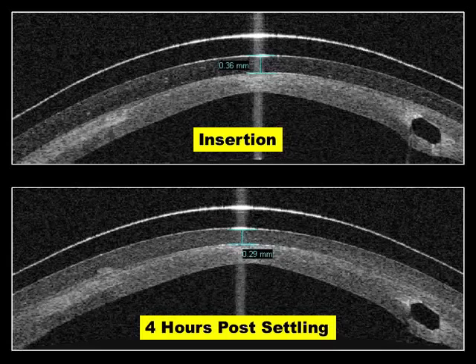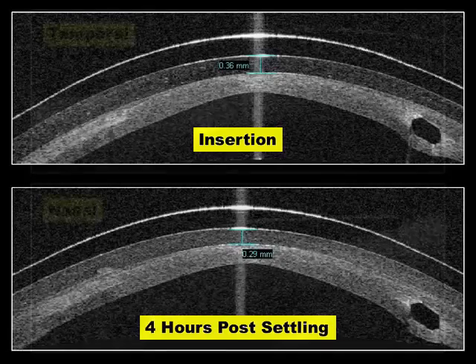Now, having so much clearance is also valuable because we have corneas that have these high and low points. They might be tilted, or in this case, this patient has a bulging cone inferiorly. So we may want slightly more apical clearance to make sure that we're clearing where the elevation of the eye might be much higher. So always shoot for more fluid rather than less.